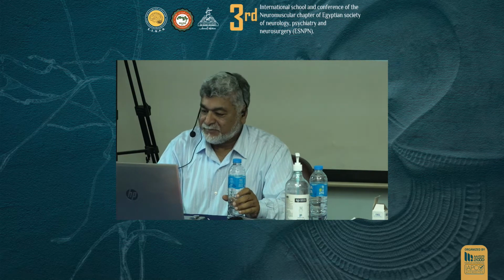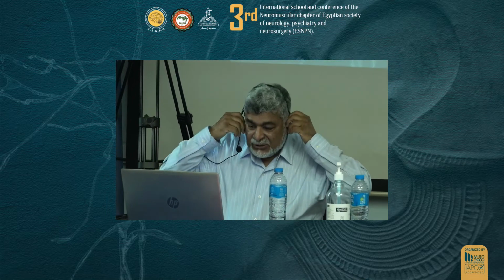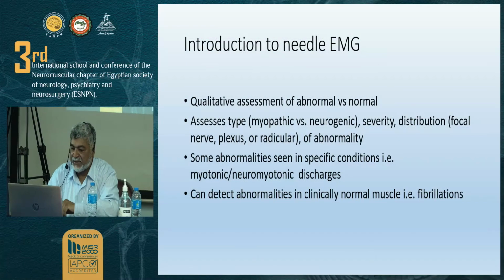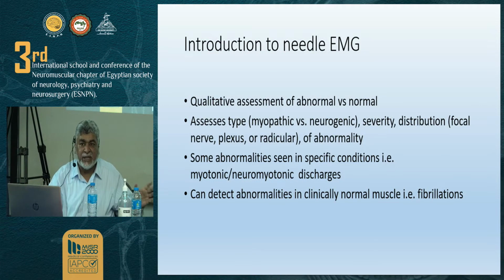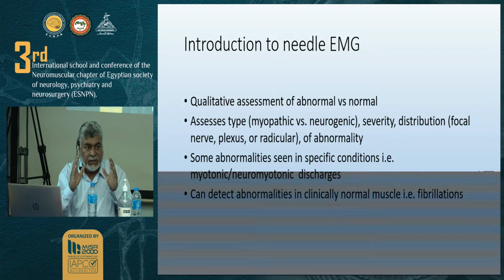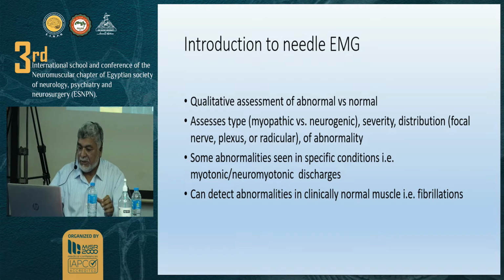Okay. So here we go. I don't need this introduction. We already covered that. I'm not going to belabor the same point. It's a qualitative assessment. You see that? There's no objective measurement, like I'm measuring this distance or the duration. It's very visual and sound, and it depends on your experience and how you do it. It's not difficult though, trust me. It takes a little while, but when you get to it, you can do it easily, okay?